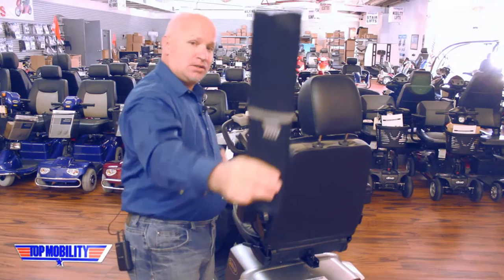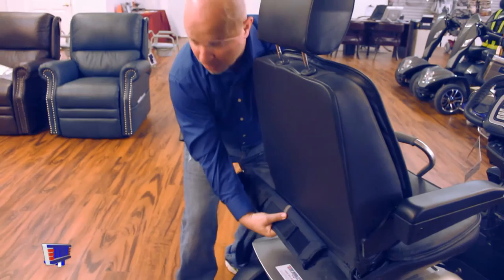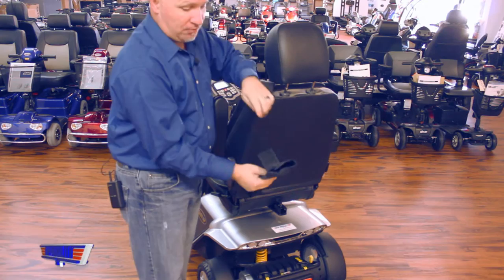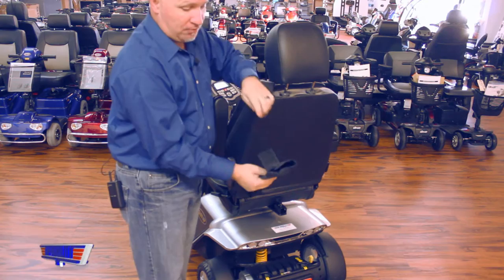Second, take the velcro strap and feed it through the seat of your scooter on the bottom, in between the back and the seat of your scooter. Bring it up as tight as you can. On the top of your cane holder, you'll have another velcro strap that's folded over — feed it on the top of your seat.